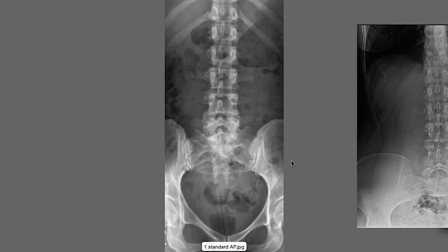We're going to look first at an AP lumbar x-ray. When you scan these images, you should have a typical scan in mind for normal, so things that are abnormal will pop out at you. The first thing I look at in an AP is the alignment of the spine and the levelness of the sacrum.